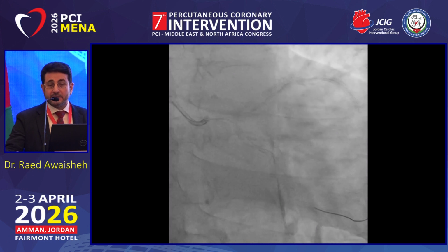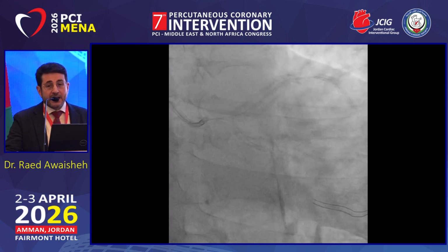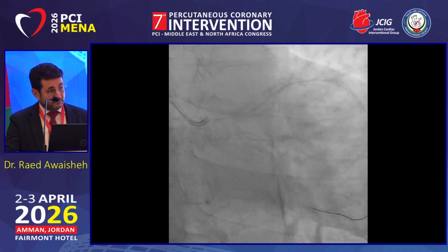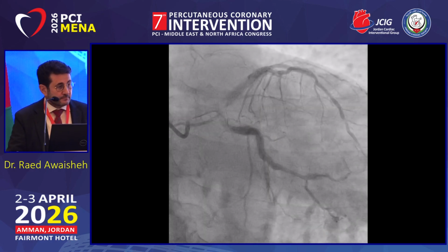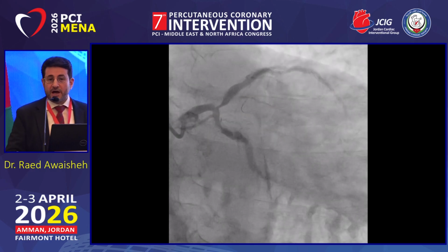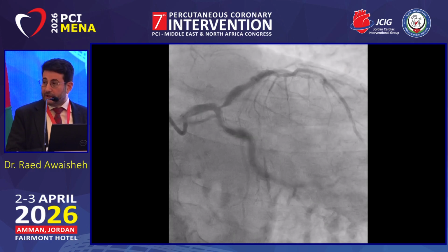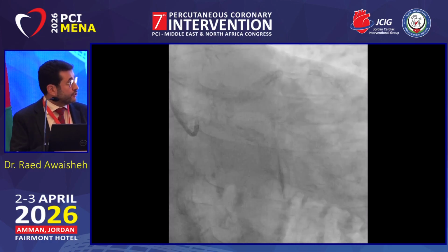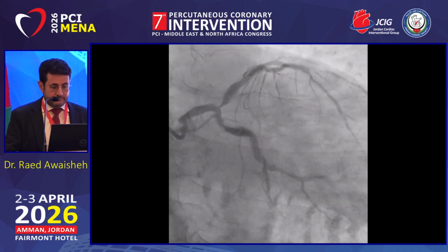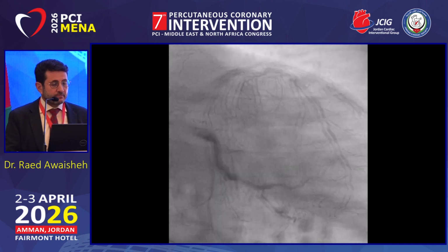This patient had this obvious nodular calcium at the ostium of the LAD, and this lesion had been tried with rotablation, but it failed. So, what to do? You have Rota, and it failed for this nodular calcium. I think it should replay. Doesn't replay. Okay, that's good. Thank you.